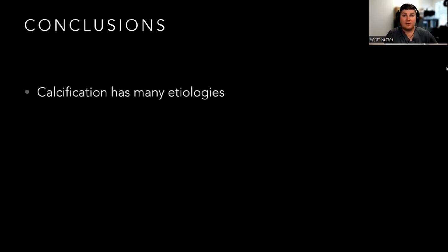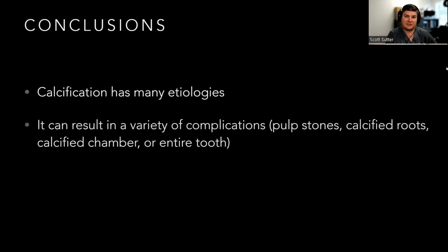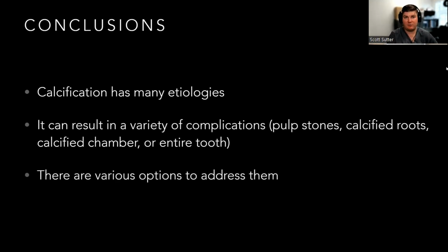Okay. Conclusions. All right, I made it. Good. We covered a ton of different etiologies for calcification. It's useful to know these so you know how to address it. Different things can happen here too. There are a bunch of different ways to address them. I just went through all the ones that I like to do. That is not all of them by far. I did use the GentleWave for calcification, just the case I did before here, because I could not get around it. It was super useful for that.